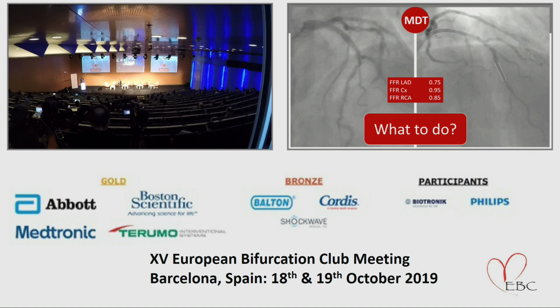That's fair, but actually it was a fairly diffuse gradient back along the whole vessel, so there wasn't a significant jump. And angiographically, one of the things that is difficult is that there is some significant haziness intra-stent suggestive of restenosis. So I don't think it's just located at the bifurcation. So Tom, did you add some significant drop between the two stents? As I say, it was a relatively diffuse gradient extending all the way back. There wasn't a significant step at any one point.